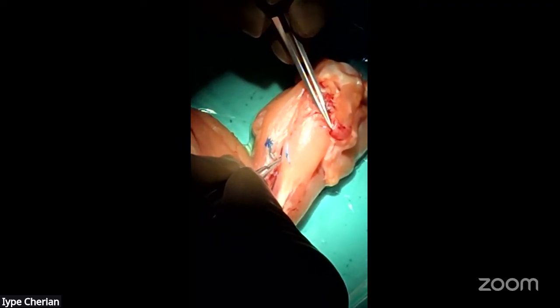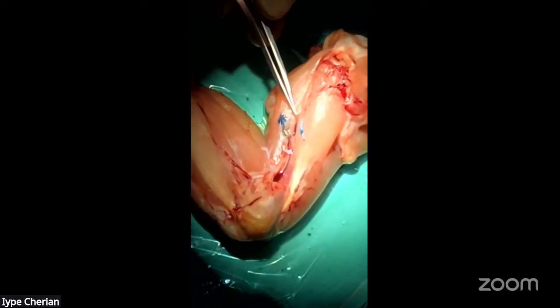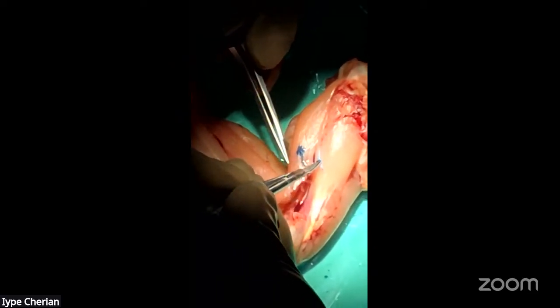The whole thing looks so easy, but it's not that easy, John. So this is how we do anastomosis, and if you have a vascular injury, this is how we do a patch repair.